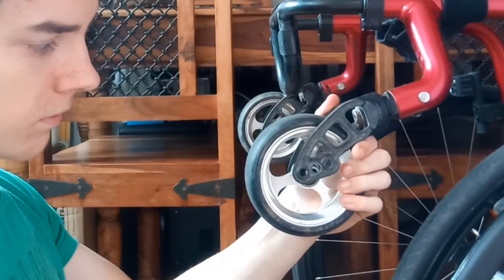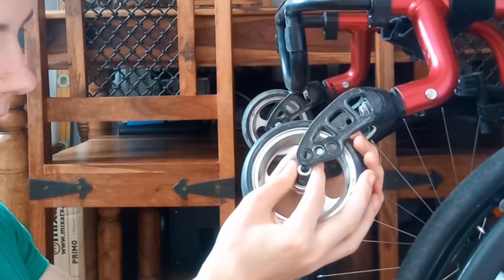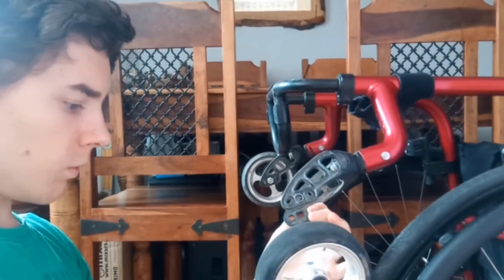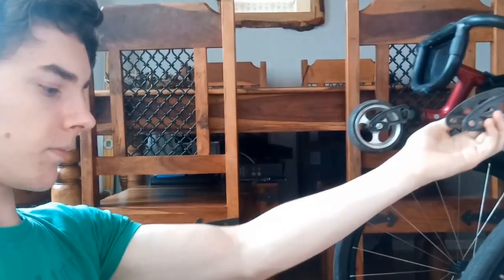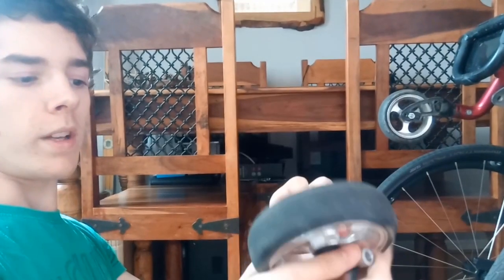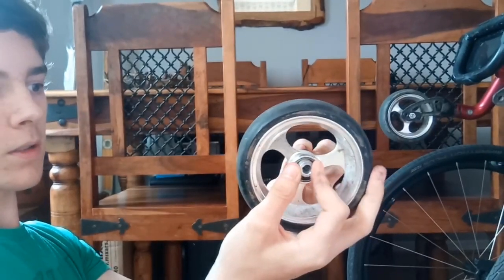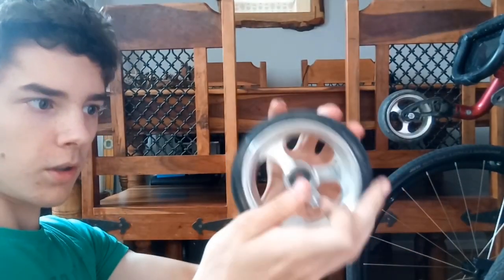Pull that out. Now, when I pull this out, a couple of things are going to fall out. There's going to be two washer type things. These things, which were there. Okay, so now you got the wheel out.